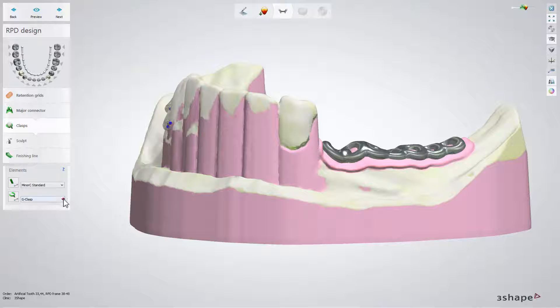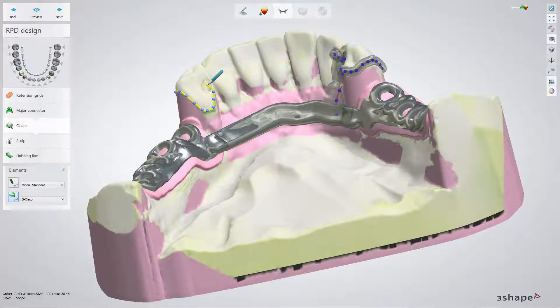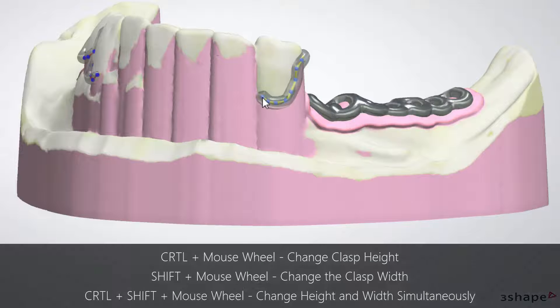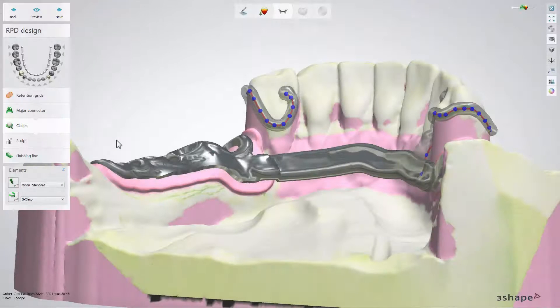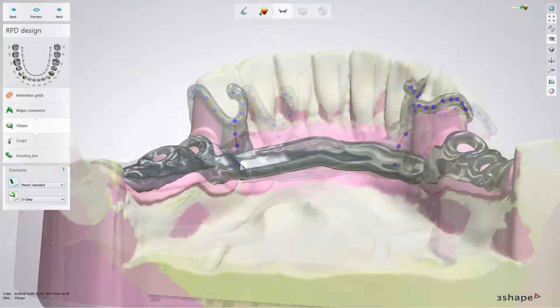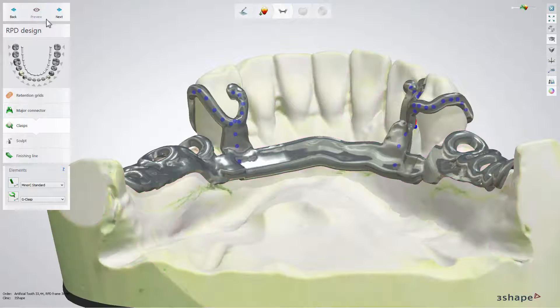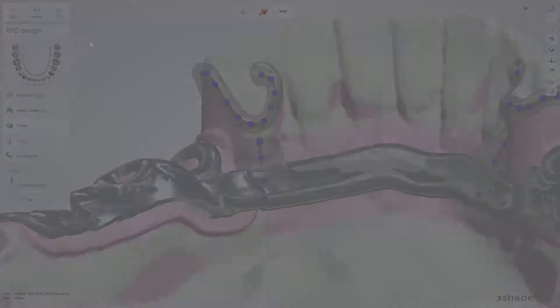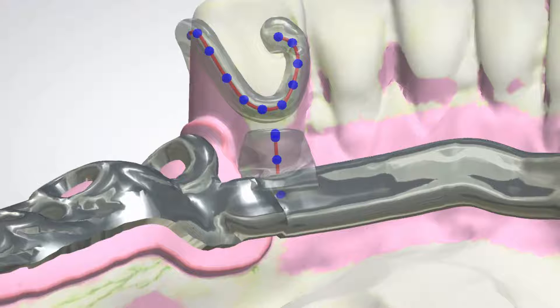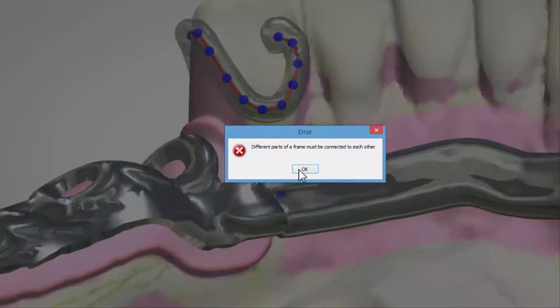To add clasps, select the preferred type from the drop-down menu and click the Draw Clasp button. It will be finalized with a single click on the last control point. You can adjust the shape of the clasps with the help of keyboard shortcuts. Here you can also place a minor connector. Click Preview to see the results. If at any stage you forget to connect the parts of an RPD, you will get information telling you to fix the design before proceeding to the next step.